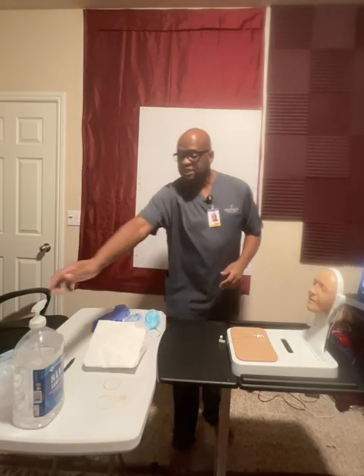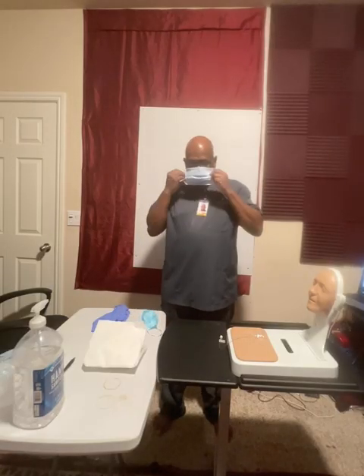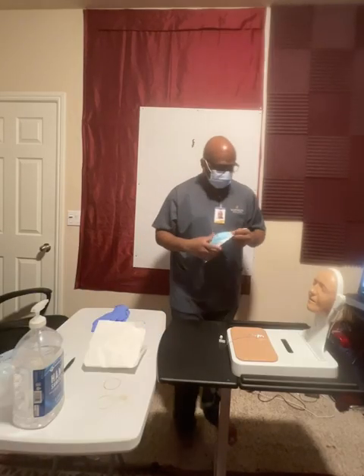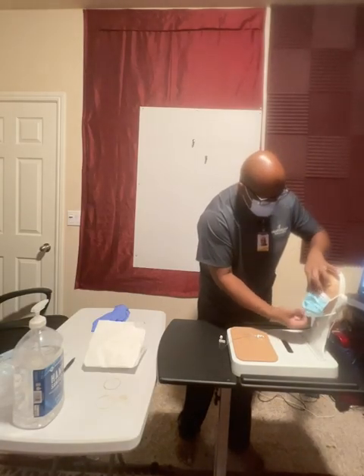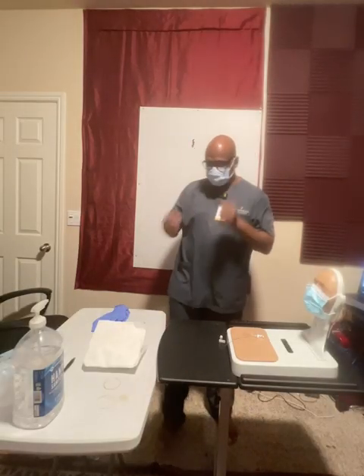So I'll go ahead and do hand hygiene first. Clean my hands, right? Then I'll put on my mask first, right? Good. My mask is on. I'll go ahead and put Mr. Jones' mask on. Okay, Mr. Jones, here's your mask. Good. Make sure his eyes are closed. Okay. Good. Now what we're going to do is I'm going to go ahead and do hand hygiene again.